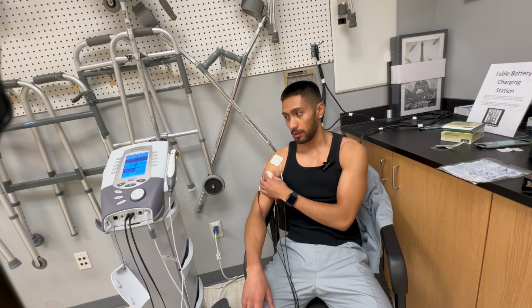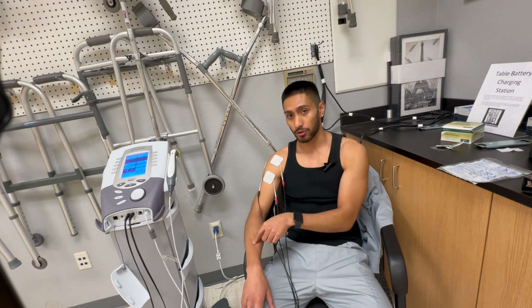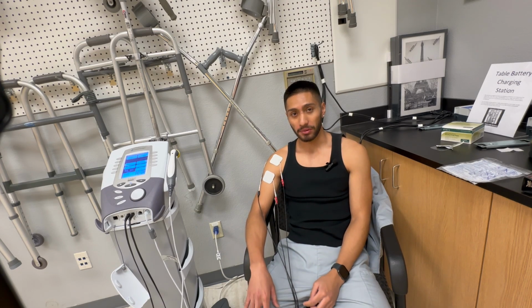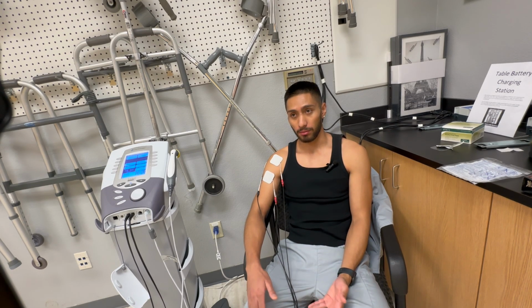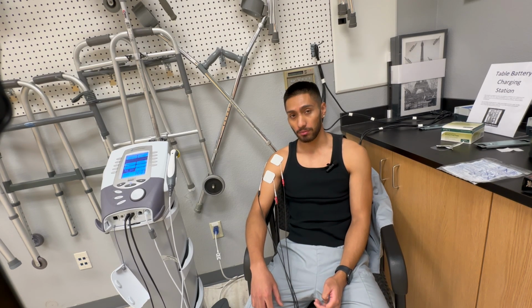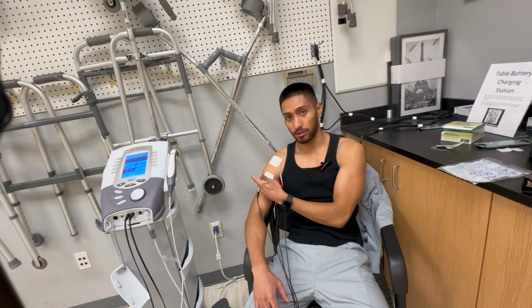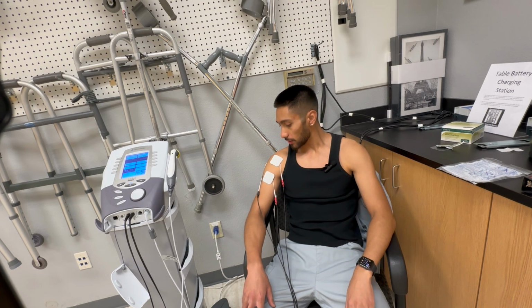It's unlike the other settings of gate control and nerve block, where those only reduce pain during the treatment time. Those have benefits in their own right. For me, I'm aiming for a long-term benefit to reduce pain once I'm outside of the treatment. So that's why I'm aiming for this when it comes to endogenous opiate release.